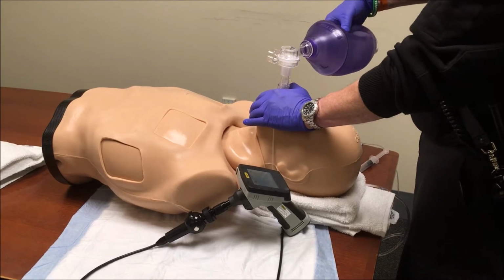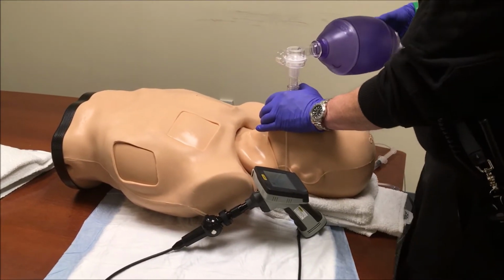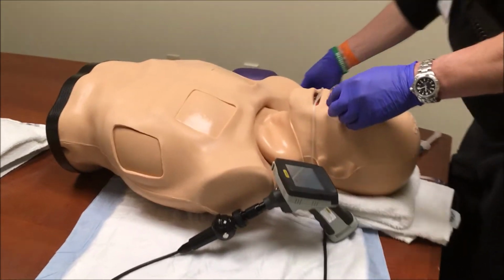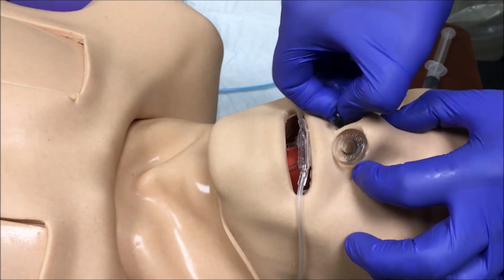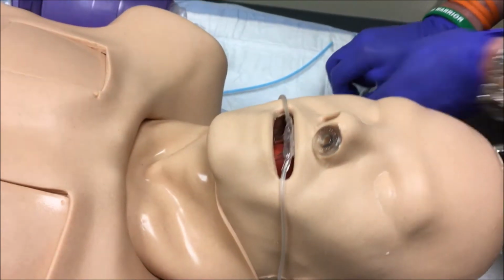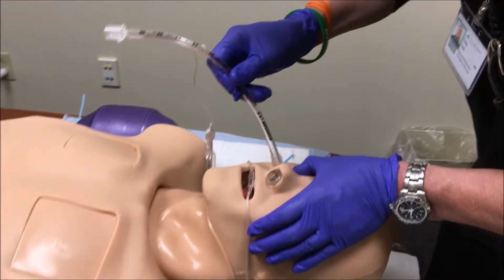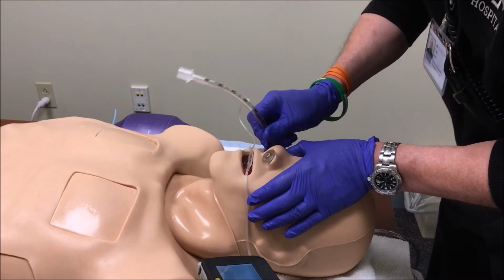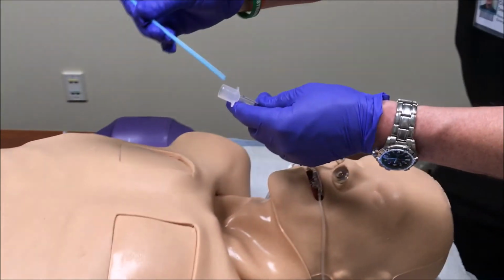We continue bagging the patient while preparing our equipment. Then we insert a nasal cannula at 15 liters per minute in the patient's mouth to assure adequate oxygenation during the procedure. Remember, the patient is breathing on his own still. We remove the NPA on one side of the nose and we replace it with an endotracheal tube with a similar outer diameter. We've ensured that the distal cuff is fully deflated and the tube is well lubricated. In this case, we're using a 6.5 ET tube.